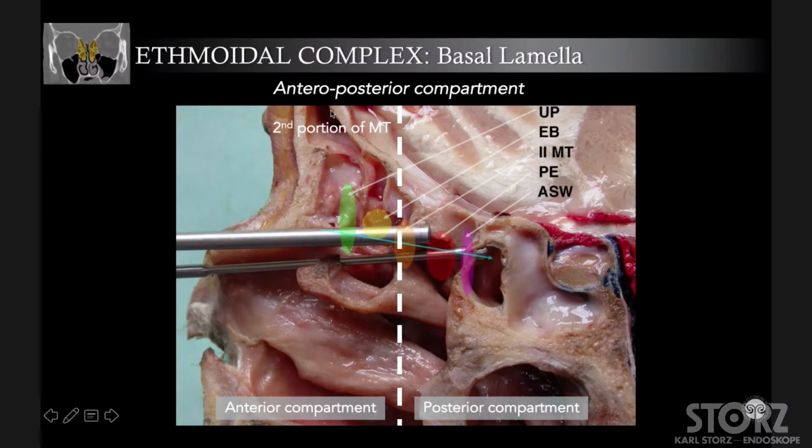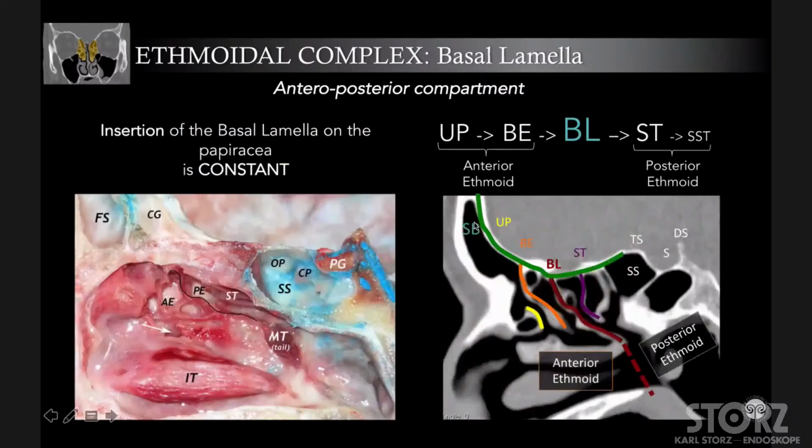But pay attention, because the skull base is not flat, but is going down. You can see it's going down. So moving from anterior to posterior, you have to be ready to approach the posterior ethmoidal roof just below. If you go straight on, you enter the skull. You have to correct your surgical instruments just below, because the anterior skull base is not flat, but is going down.